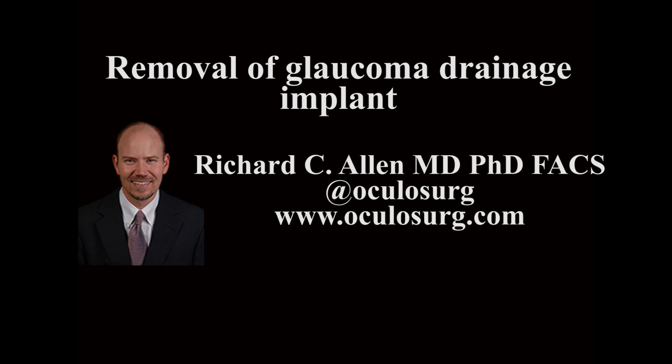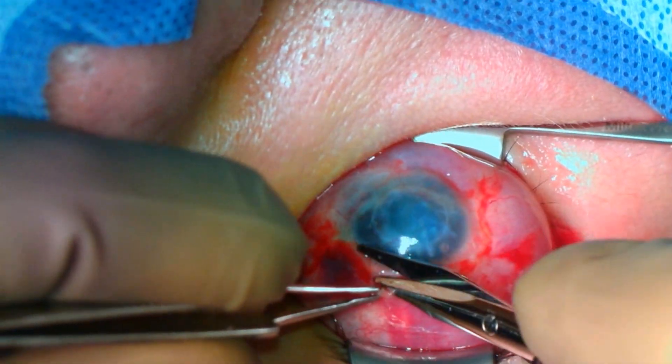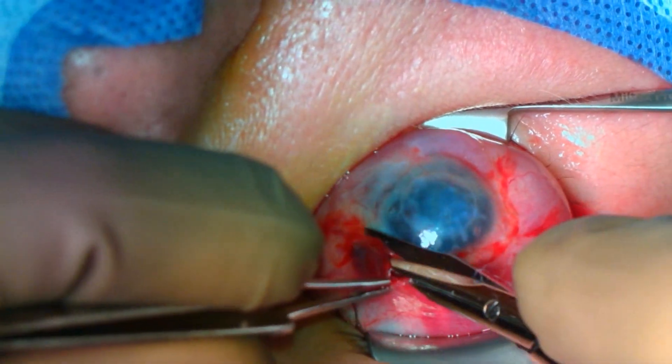This is Richard Allen at oculosurg.com. This video demonstrates removal of a glaucoma drainage implant at the time of evisceration surgery. I believe that all periocular foreign bodies should be removed at the time of enucleation or evisceration.